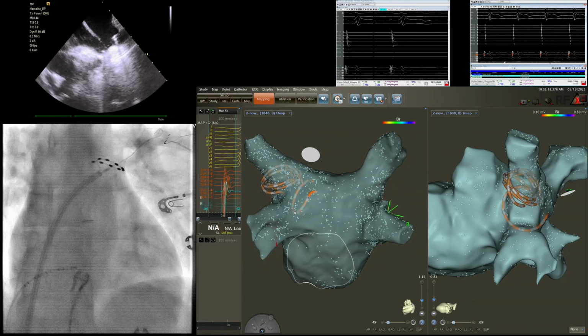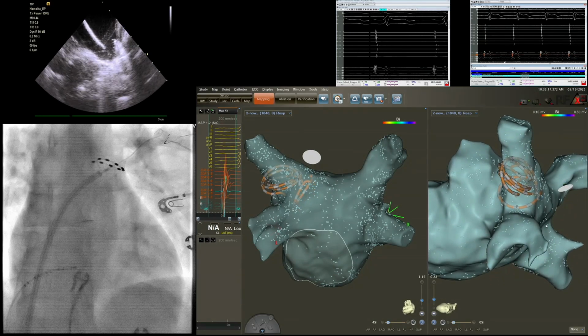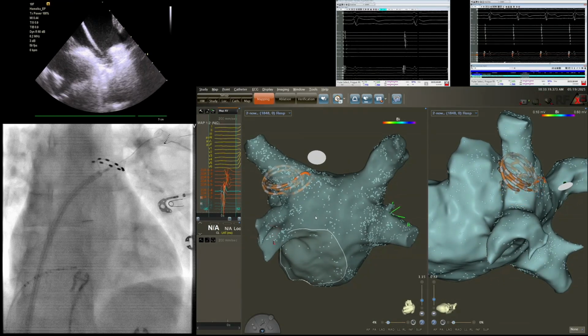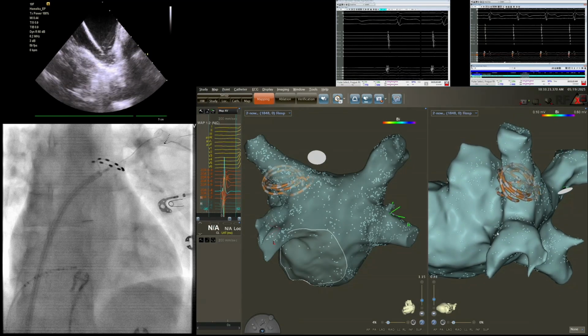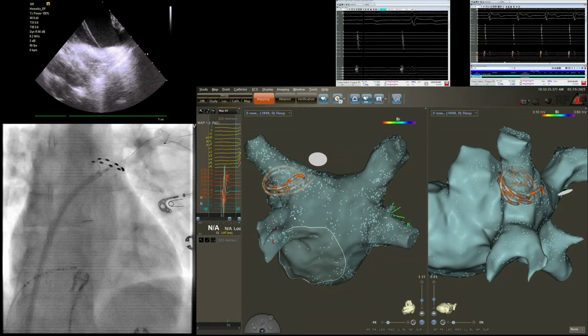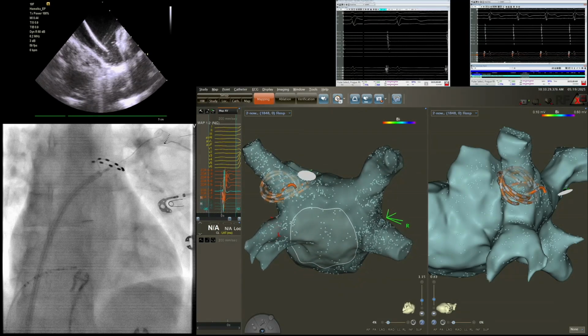So I will go more. Okay. Now it's go. Perfect. Nice. Now you have nice potentials. Okay. And I have different, okay. Give me top roof on the right side, Martin. Give me top down.